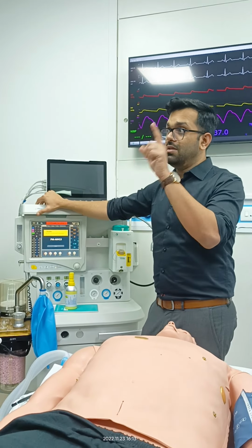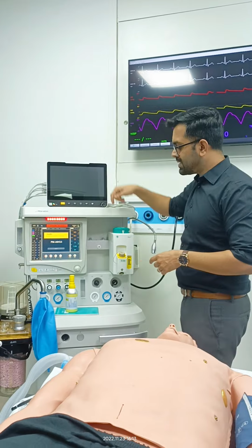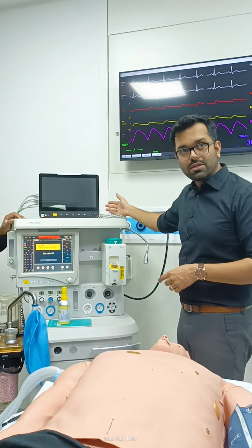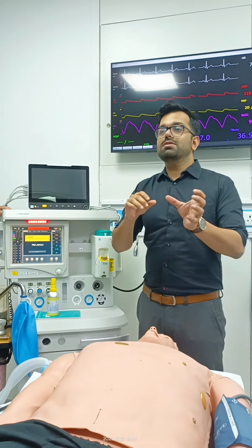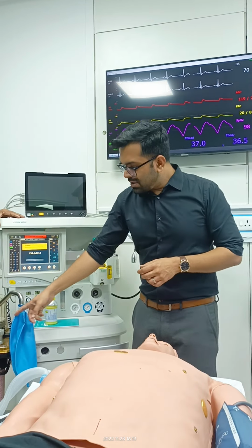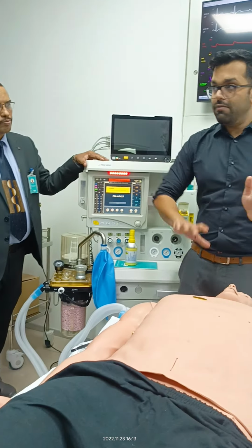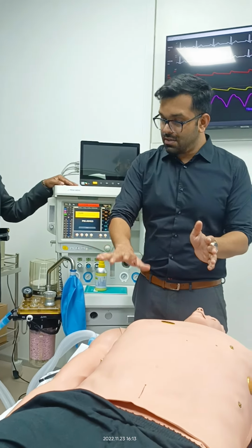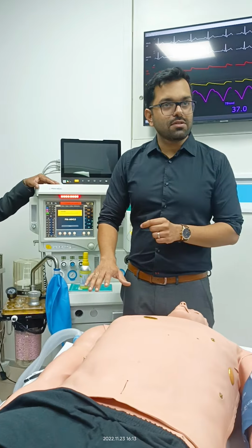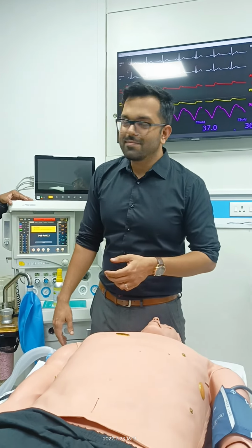By air, I mean atmospheric air, which is compressed in these cylinders and then comes through the tubings connected to the back of the machine. So your oxygen is getting diluted by compressed air. The gas coming through here has 50% oxygen and 50% compressed air, and that compressed air also has 21% oxygen.